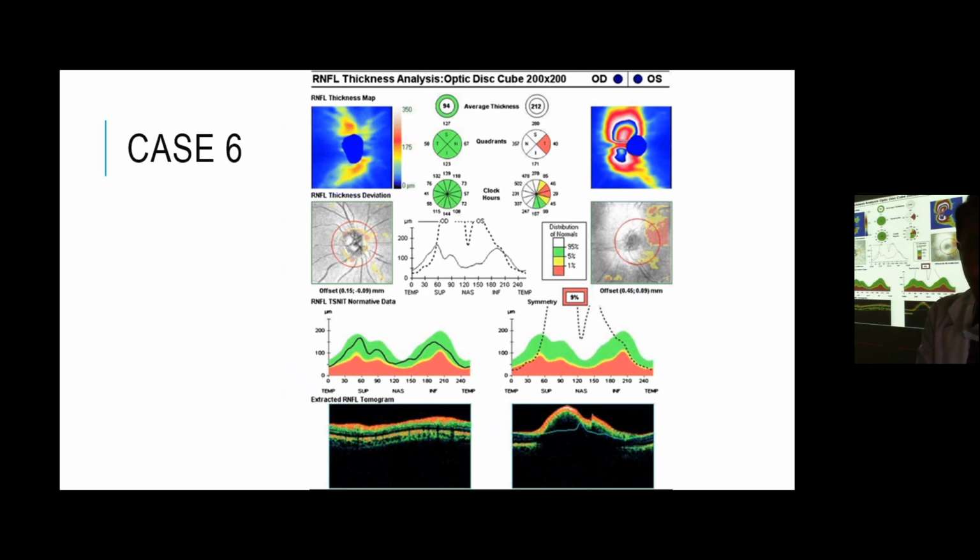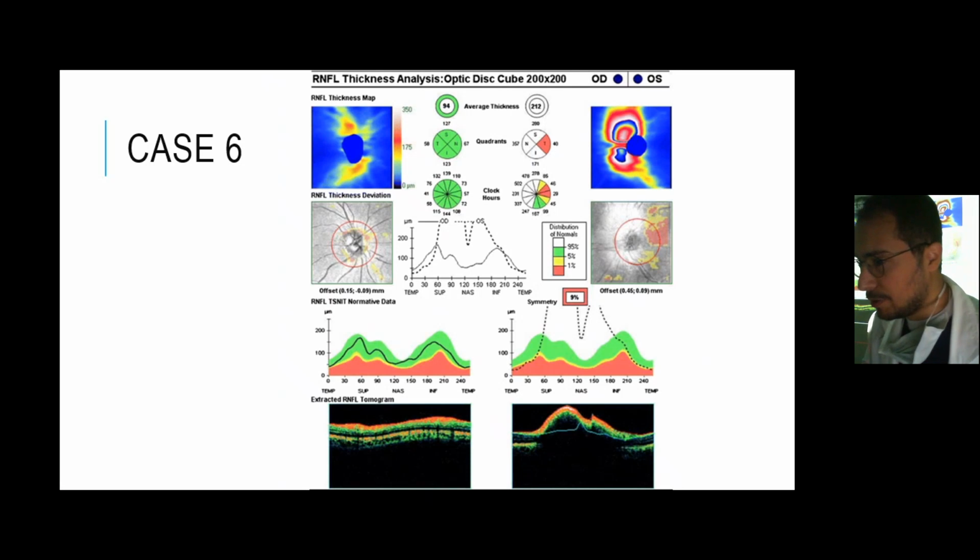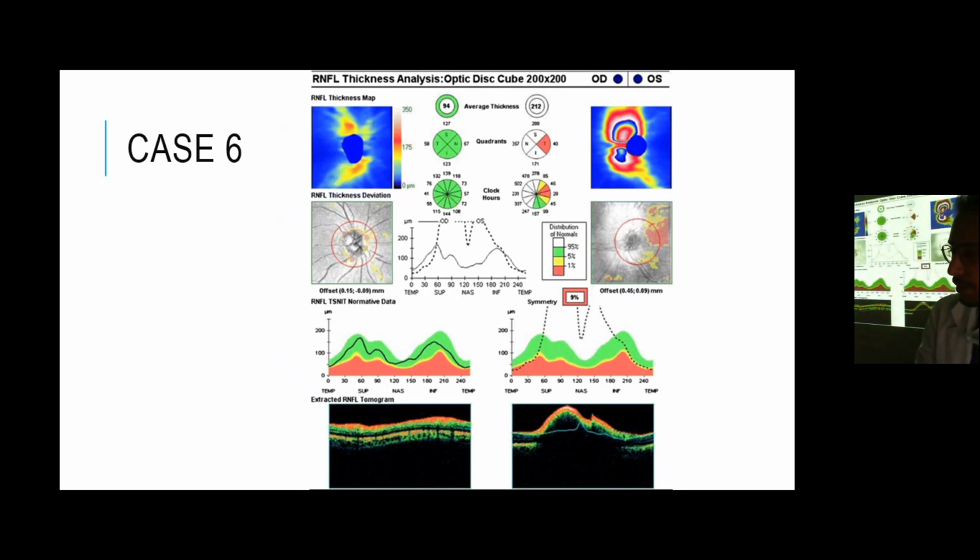Also, when you want to compare OCTs, you don't take one reading. If you saw a patient today and you do an OCT, there is thinning compared to the last one, but everything else is normal, you don't suspect he's progressing. You don't jump and treat the patient or overtreat the patient. It can be something wrong with the test. You can repeat it later on. You can give him a near appointment and repeat it again. Do other tests. So we should take the patient as a whole. We should see him clinically, do all the tests. We don't rely on one thing.